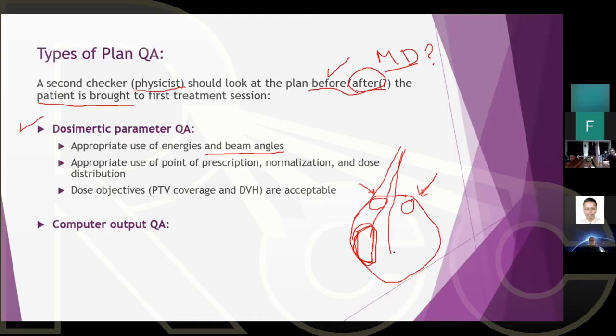Actually, this was an arc treatment. This was a VMAT treatment. It's not 3D per se, but it was a VMAT treatment. And there was a good 20 degrees. So there's a half arc going like this, and about 20 degrees were going through the right eye.